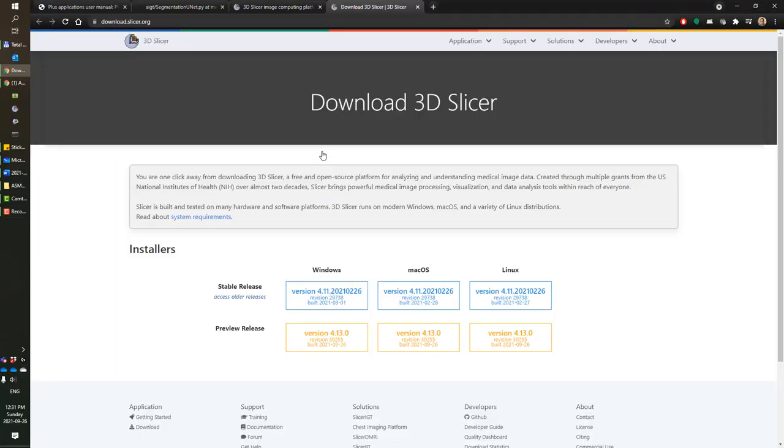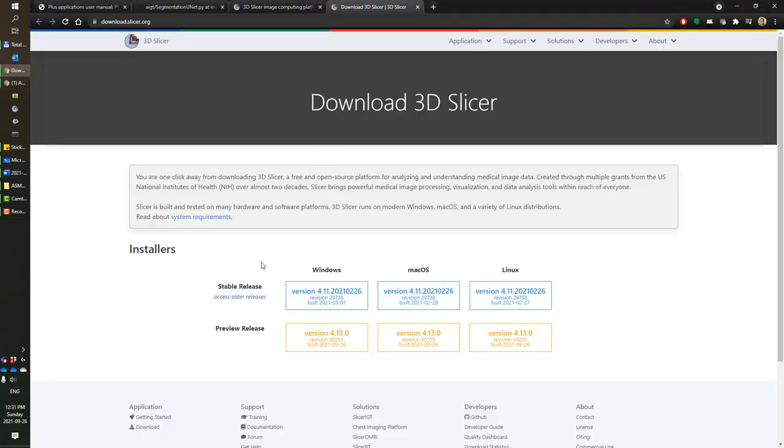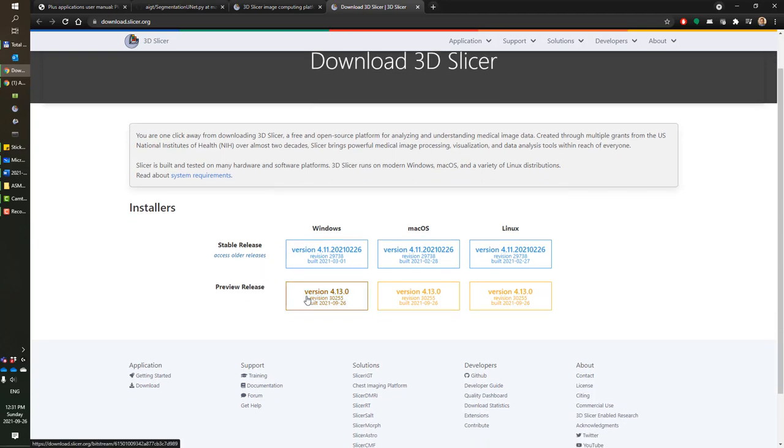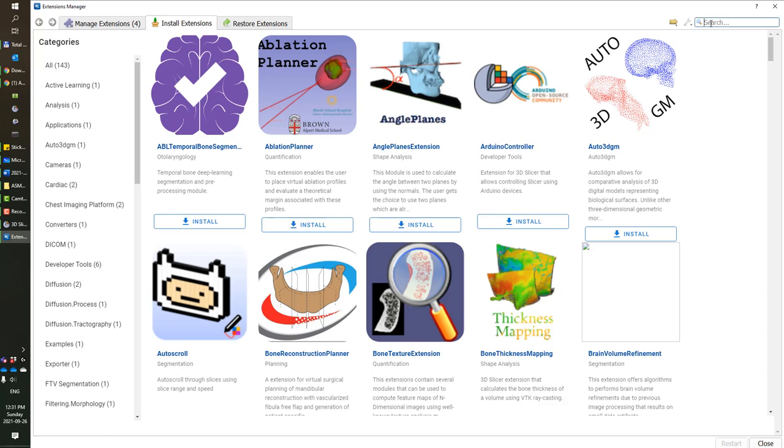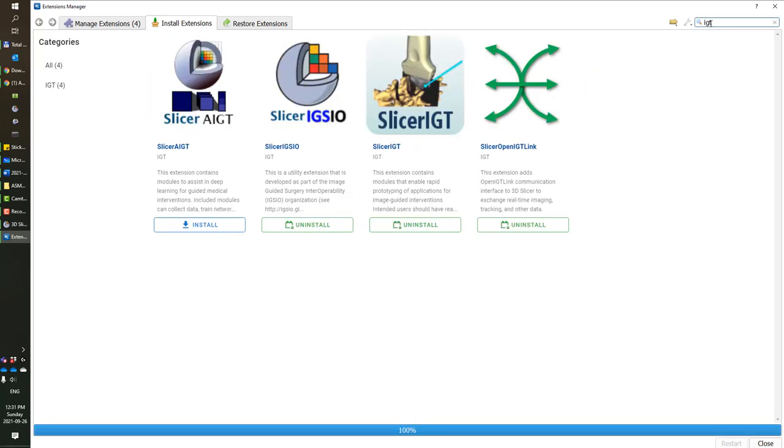First, make sure you have a recent build of 3D Slicer application, and once you've installed it, open the extension manager, search for IGT in extensions, and make sure these three extensions are installed: the IGSIO that includes volume reconstruction, Slicer IGT for real-time visualization, and OpenIGTLink for a situation where you want to connect to real hardware.